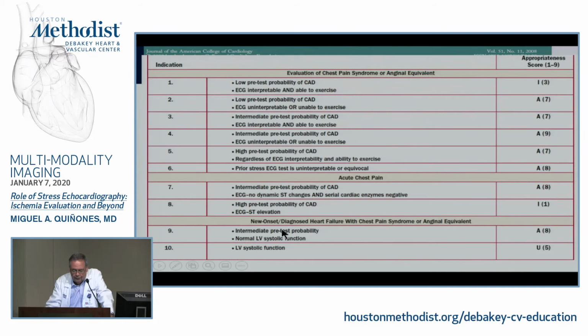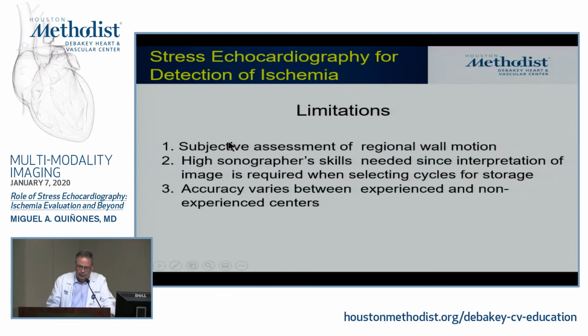So they're valid tests. They all have very similar appropriateness as a nuclear. If you put this and nuclear together, they're exactly the same in terms of the recommendations for appropriateness used in the clinical setting. Limitation is a subjective, as we have said.